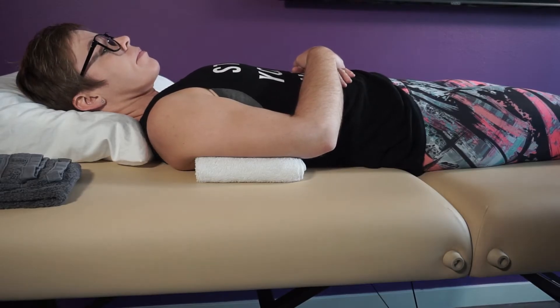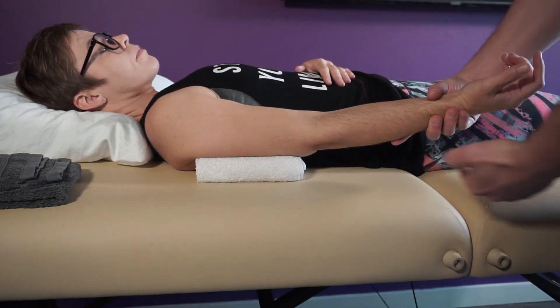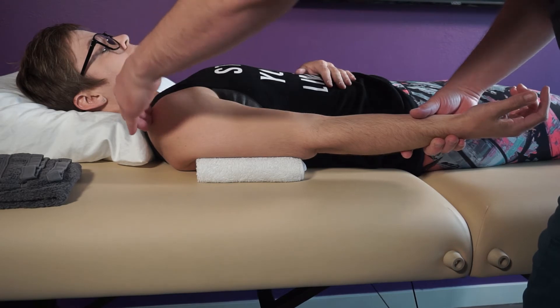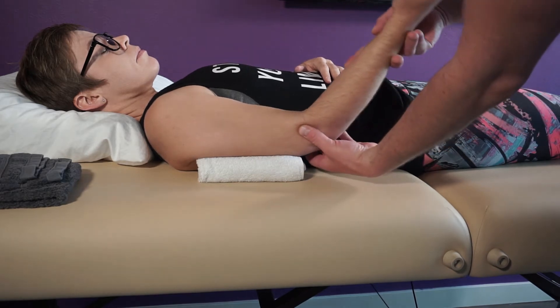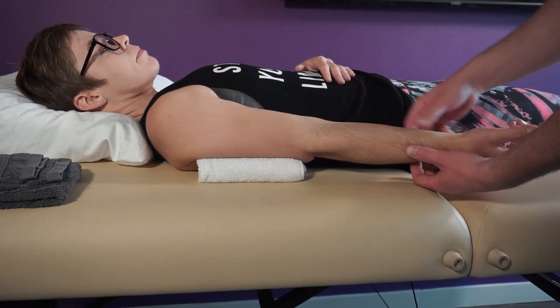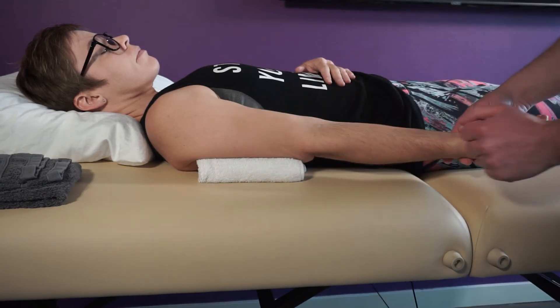In this video we're going to do goniometric measurements for elbow flexion and extension. Make sure you get that towel under there and keep that humerus parallel to the ground. Our landmarks are the lateral aspect of the acromion, bisecting the humerus down to the lateral epicondyle, then following the radius down — keeping the forearm in anatomical position — to the radial styloid process. Those are our landmarks for both flexion and extension.